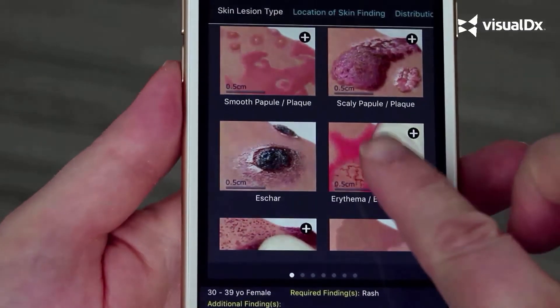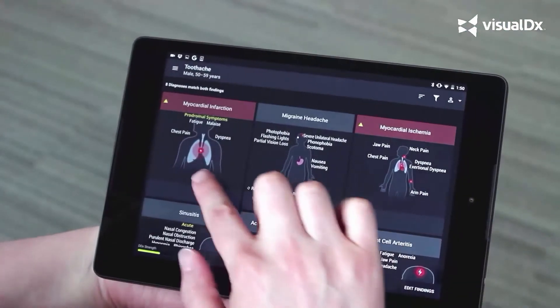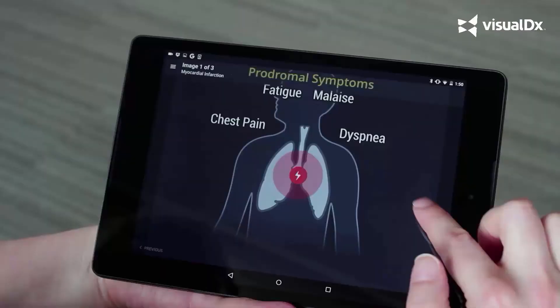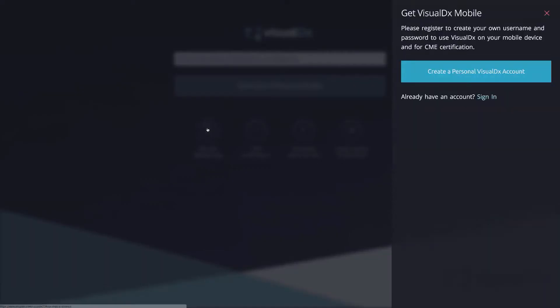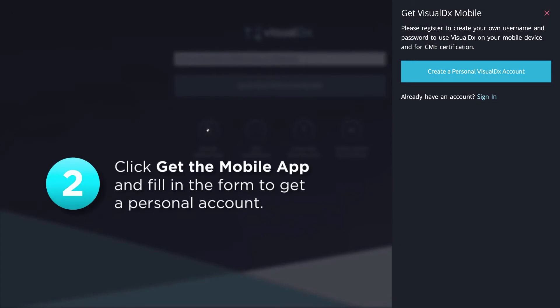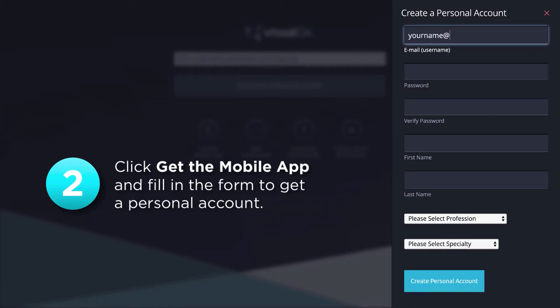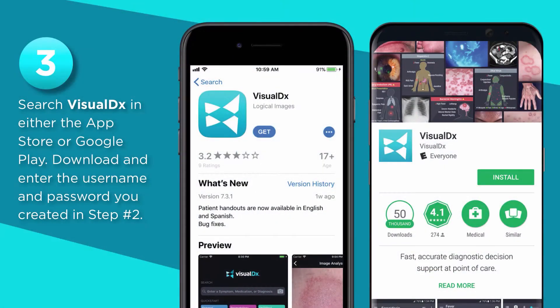You can access VisualDx anytime, anywhere by creating your own personal mobile account. Here's how. From a clinical computer, go to visualdx.com/visualdx. Click 'Get the Mobile App,' then create your own personal account by filling out the simple form. Download the VisualDx app to your Apple or Android smartphone or tablet. Then launch the app and sign in with the credentials you created, and you're ready to go.